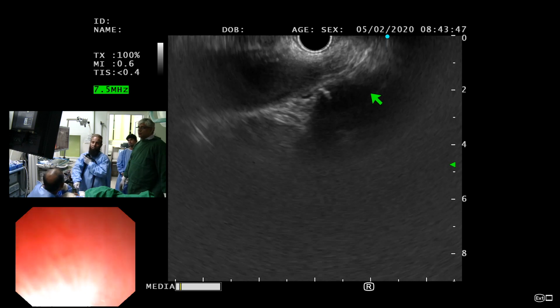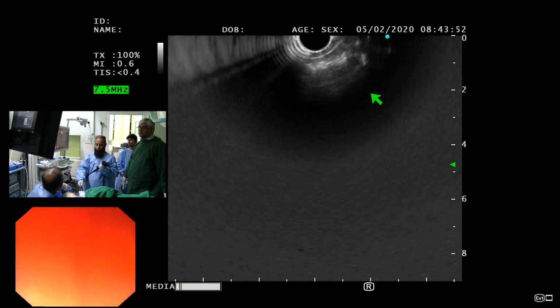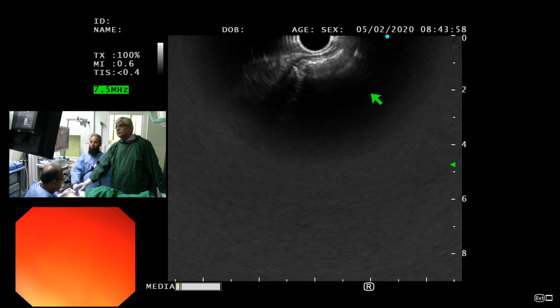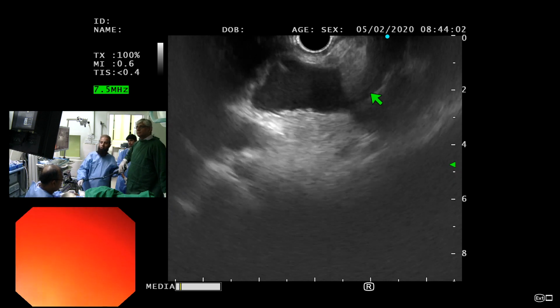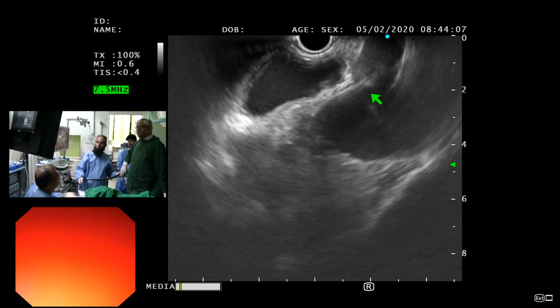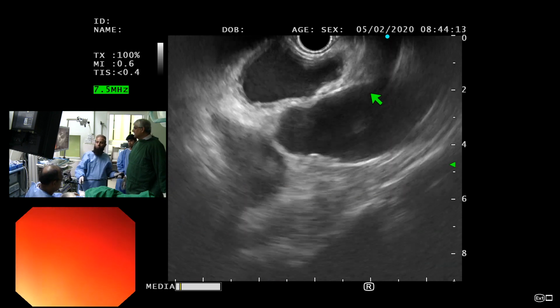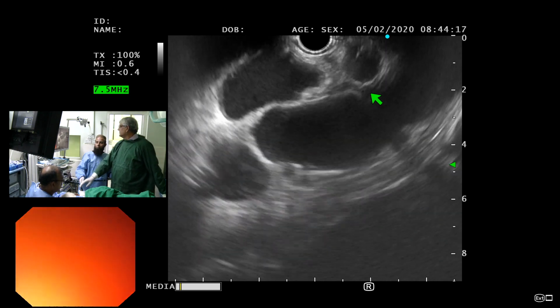So you come back and show me subcarina quickly, please. So subcarina, what I do is 35, 35, in women 30. Okay. So now a little bit of, and tip up. Tip up a little more. See, so you actually got subcarina straight. You pull back a little bit.